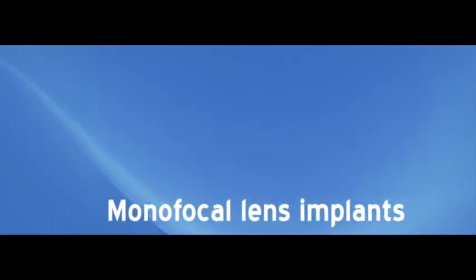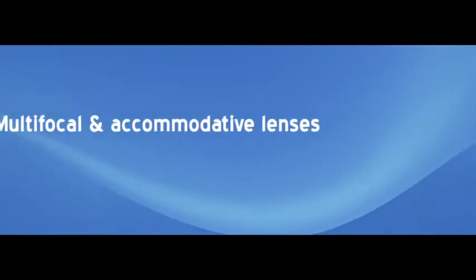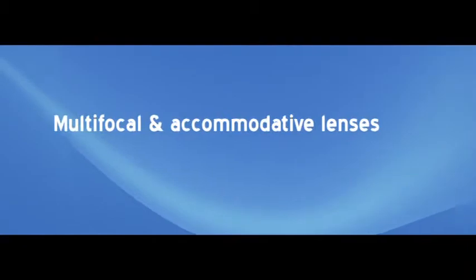Traditional monofocal IOLs usually provide either near or distance vision. Eyeglasses or contact lenses are used with monofocal IOLs to achieve the appropriate range and sharpness of vision not provided by the monofocal lens. A newer generation of IOLs, known as multifocal and accommodative lenses, can provide for near, intermediate, and distance vision, allowing you to be less dependent on glasses. IOLs that treat astigmatism are called toric IOLs.